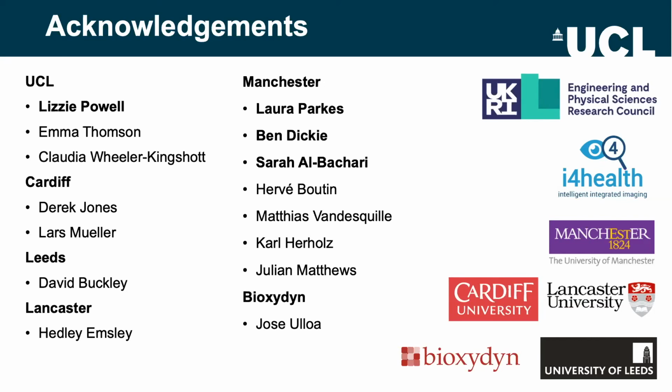From a pure SNR standpoint, one might imagine those techniques could be much more sensitive than things, for example, looking for small water contributions. Yet in practice, that's not the case. So what's dominating the noise? Yeah, I think it's multifactorial, but probably the biggest single thing that I get concerned about is the point spread function from the vasculature.